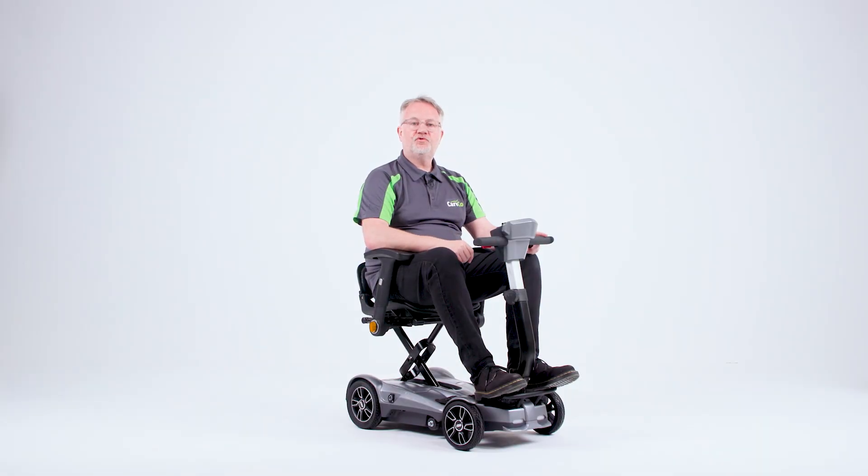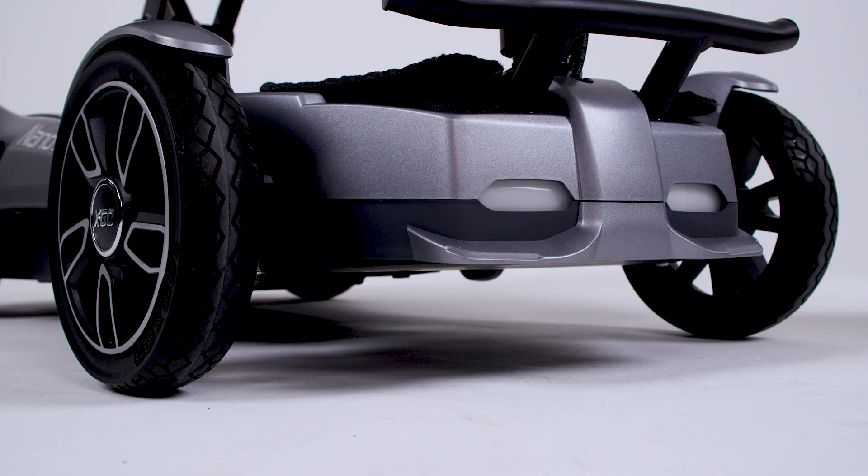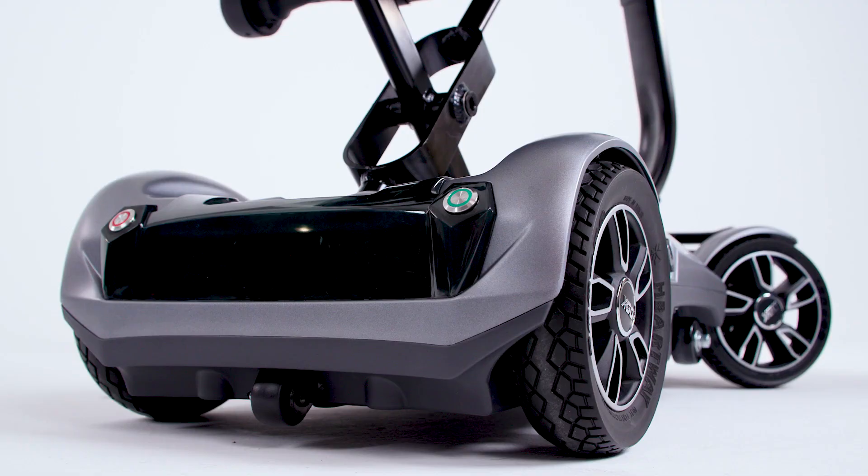The X-Go Nano comes with an inbuilt sensor which senses when the light goes dark and brings the lights on automatically at both the front and the rear. Alternatively, there is a button that you can press, and as you can see the front lights have illuminated and the rear light has illuminated also.